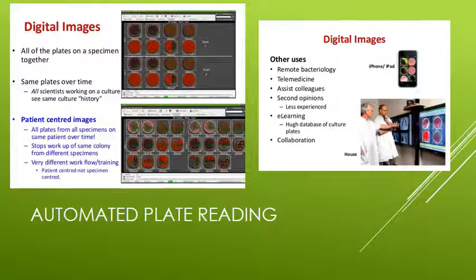So if I read a culture today and I look back in the patient's history and I say, gee, Susie Q read a culture from the same site 3 days ago. She saw no growth, but look at me, I'm seeing all this strep pneumo. I wonder what she really saw, if it was really the same specimen. We never had that kind of luxury in micro, because once you read the plates, they were gone. Especially if there was no growth.